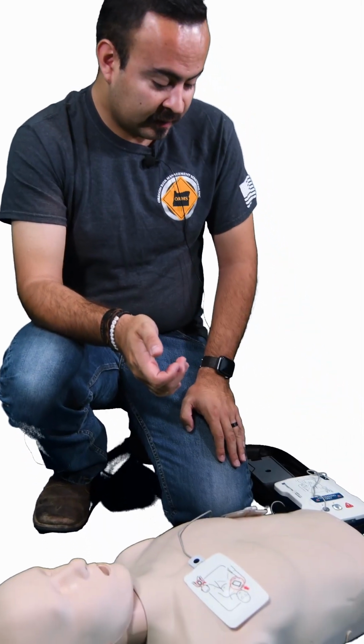Otherwise, make sure you remain calm and that you do good quality chest compressions and that you listen to the instructions of the AED as it gives them to you. Other than that, that is pretty much it. And you're going to be doing this until responders show up, which could vary depending on where your location is. But the quicker you call, the sooner they will get here. And that is it.